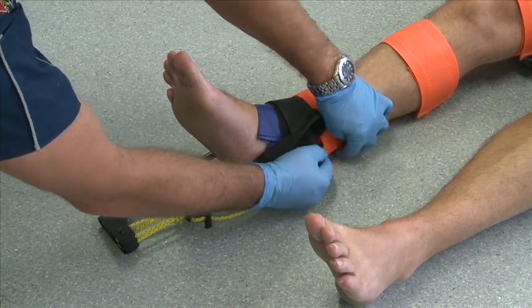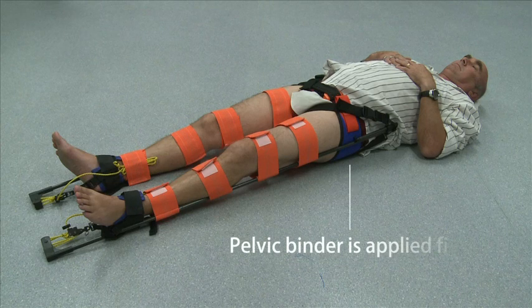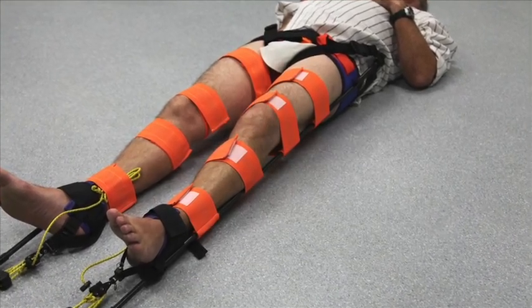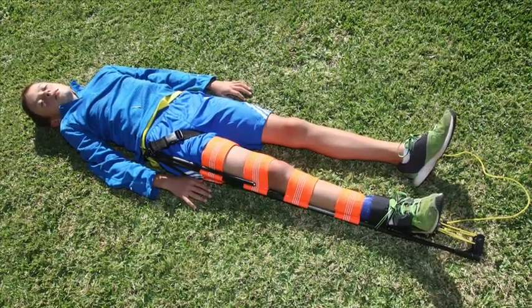The CT6 can be applied after the pelvic binder is in place. The CT6 can be applied to bilateral femoral shaft fractures. And the CT6 can be applied to children with fractured femurs.